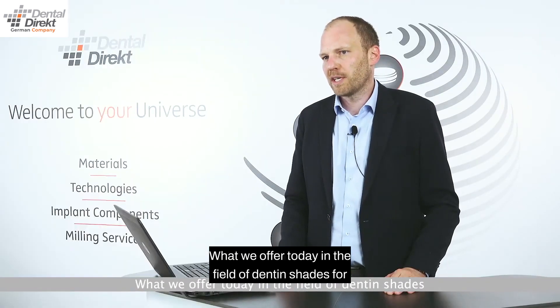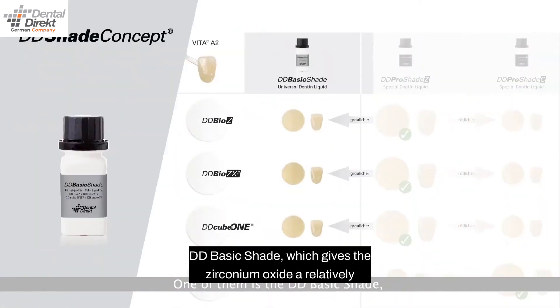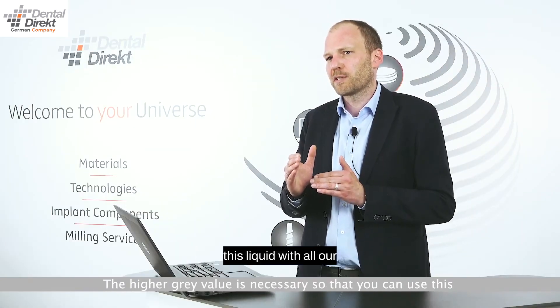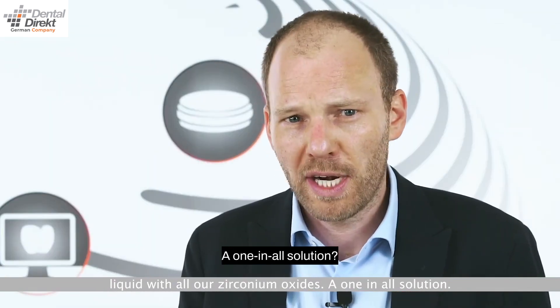What we offer today in the field of dentin shades for white zirconium oxide are three solutions. One of them is the DD Basic Shade, which gives the zirconium oxide a relatively intensive chroma but is also characterized by a higher gray value. The higher gray value is necessary so that you can use this liquid with all our zirconium oxide — an all-in-one solution.